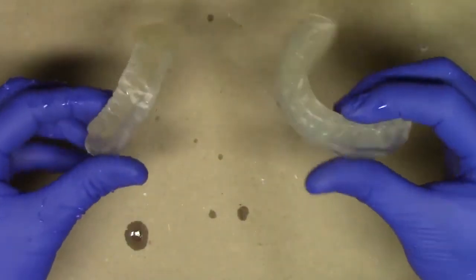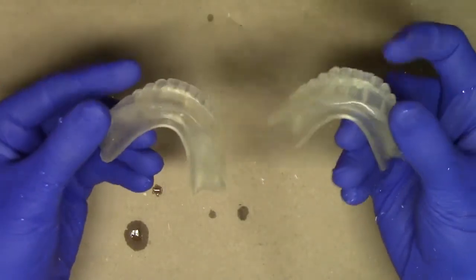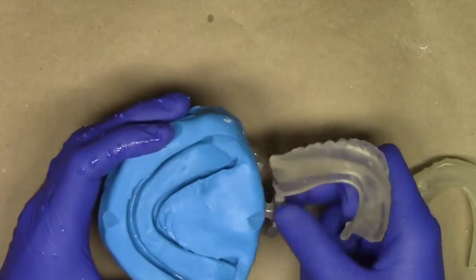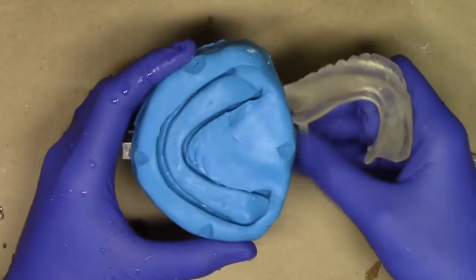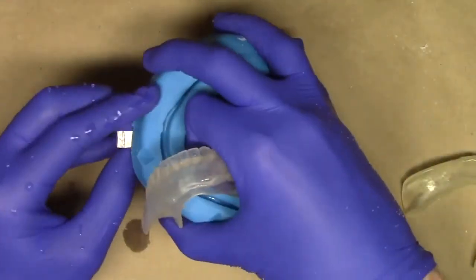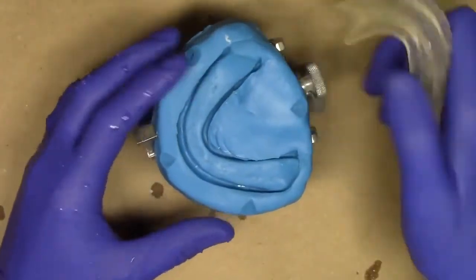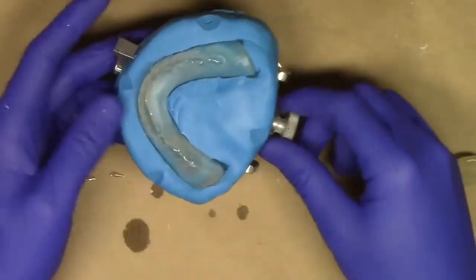Now, to get to this point where we punch in our 4 holes into our complete denture, we need this little simple device and our putty. What we're going to do is just take out a surveying table and put our putty onto the end of it. It doesn't have to be exact, as long as it holds nice and firmly, as we see here.